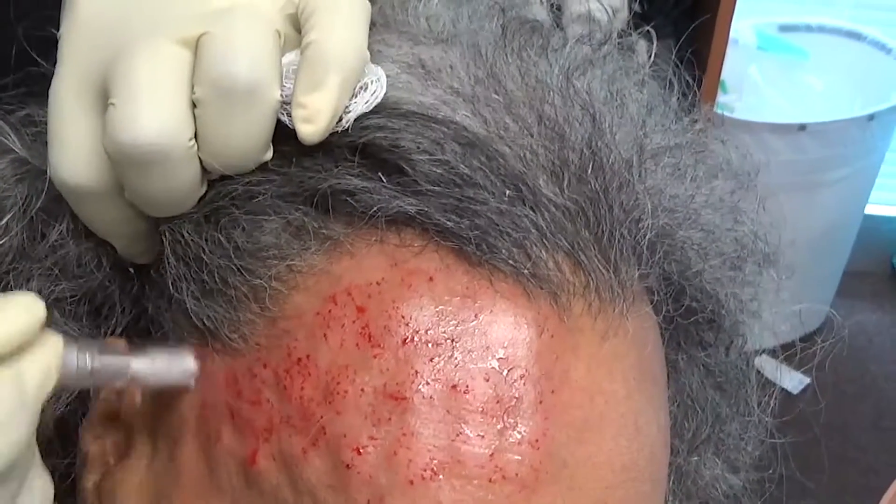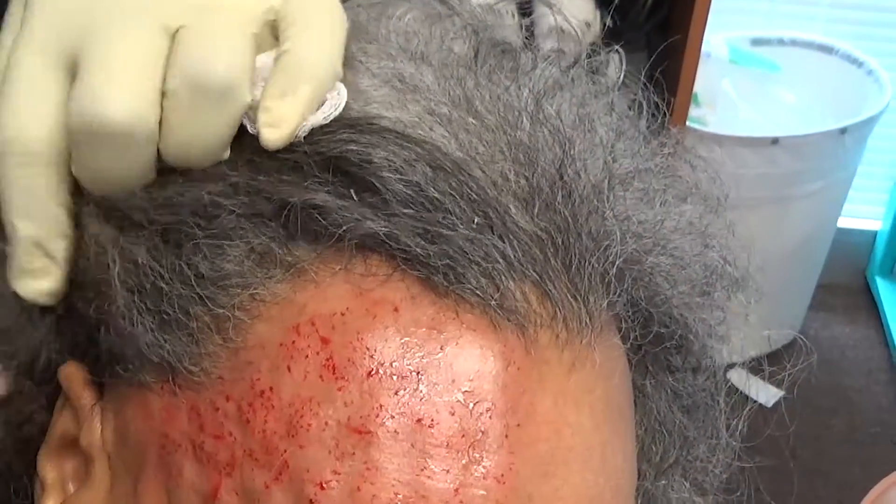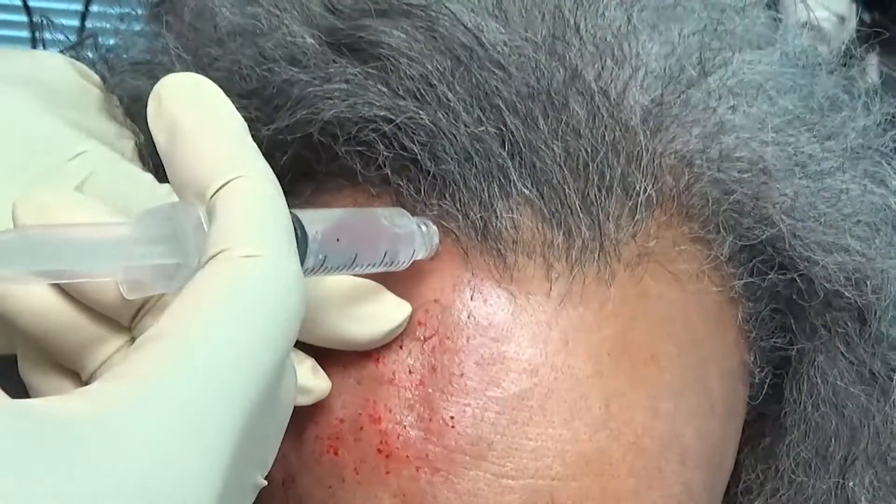And it goes very quickly. Here goes the amnio — you can see it just kind of glides on. Now I'm just going to massage it in.